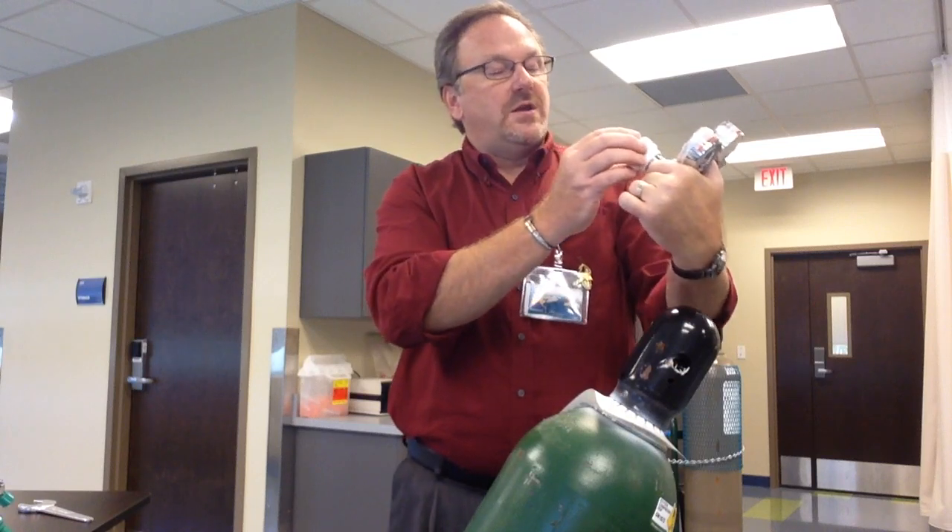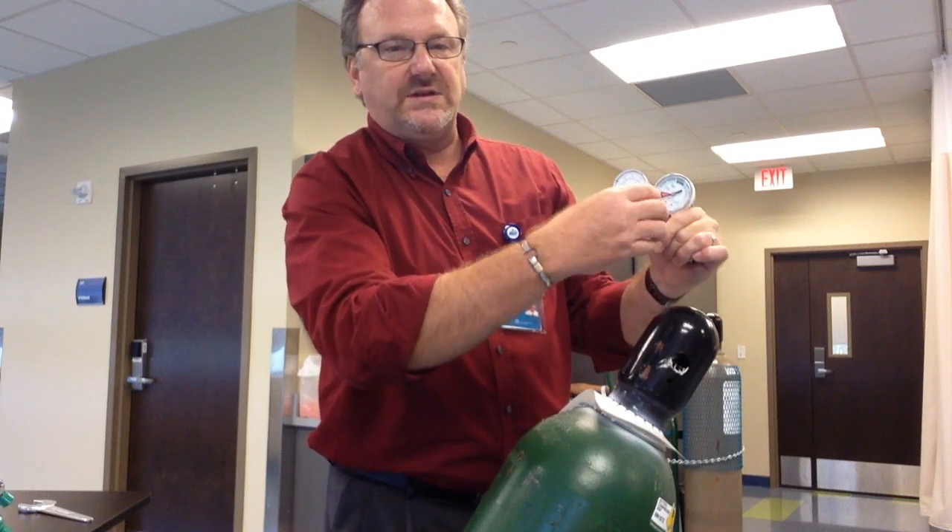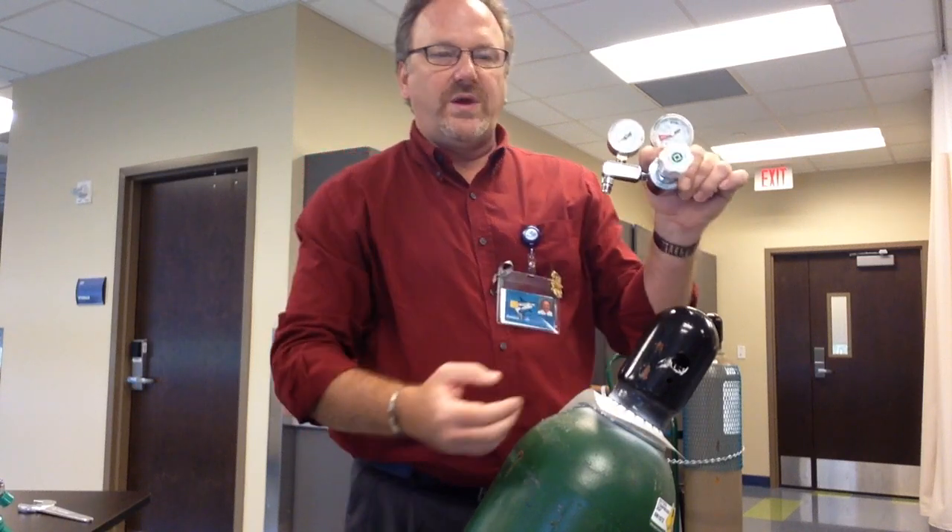Before you put it on, you want to make sure it's all the way off. If you read it, it says increase and decrease. You want to make sure it's all the way decreased.